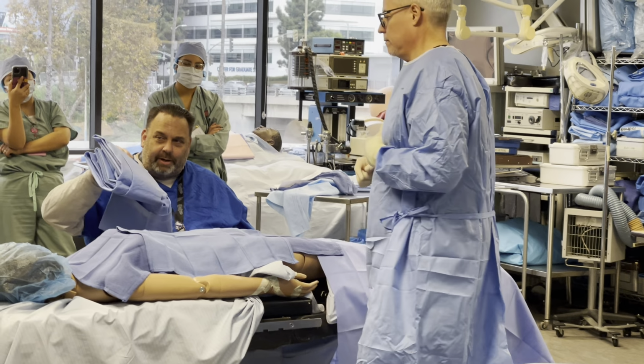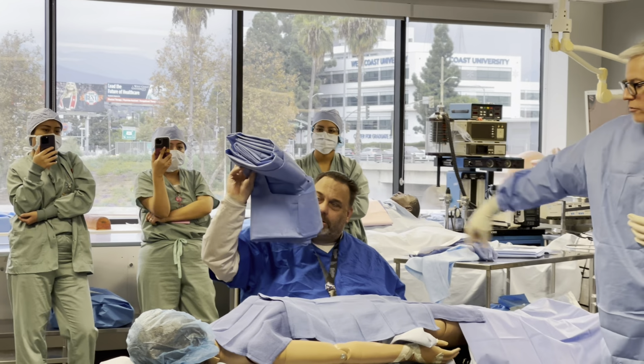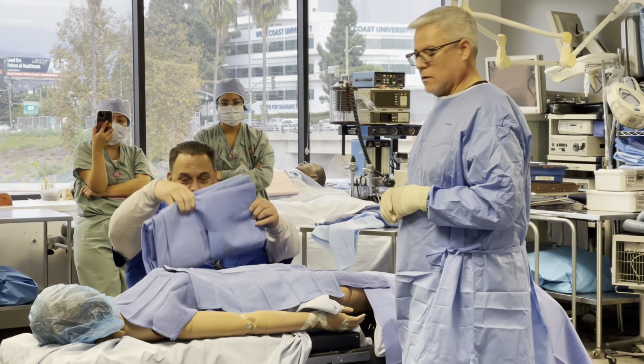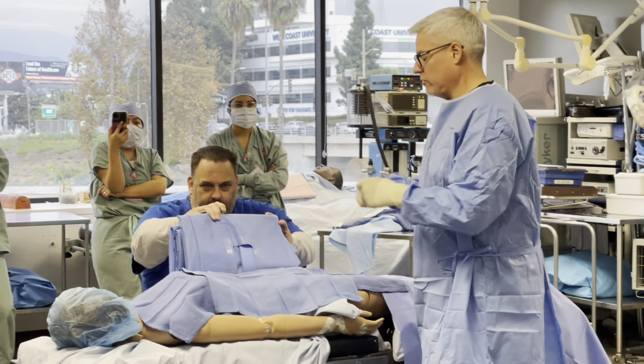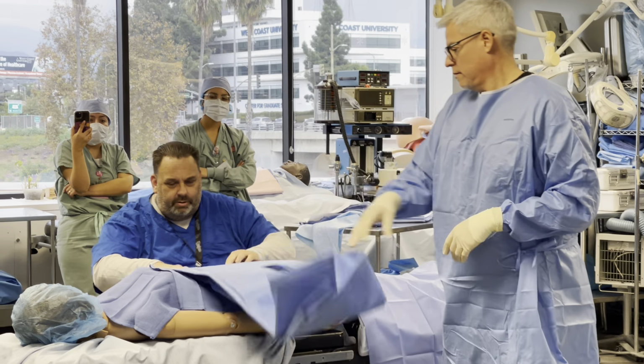And how do you do this the right way? Because the little man says so. See the little guy under? Head to head, foot to foot. You should be good to go. Okay. There's stickies on here which we already took off. You guys remember the white things? The white tape? So I took all those off. If the nurse is not around, just drop them on the floor. We'll get them later.